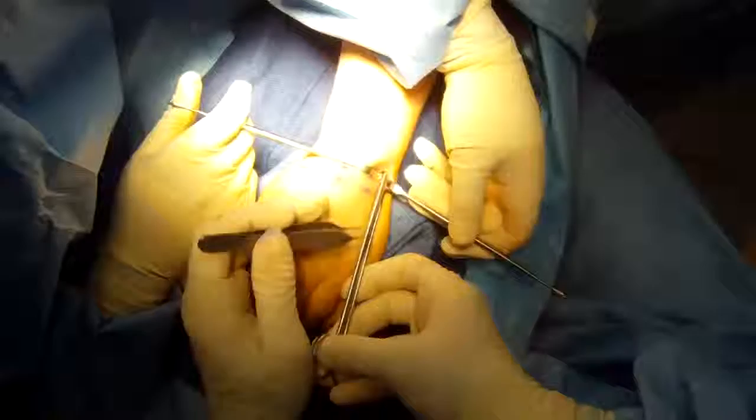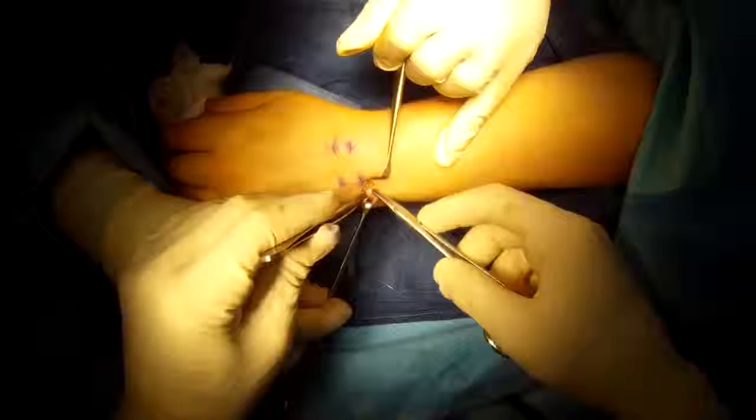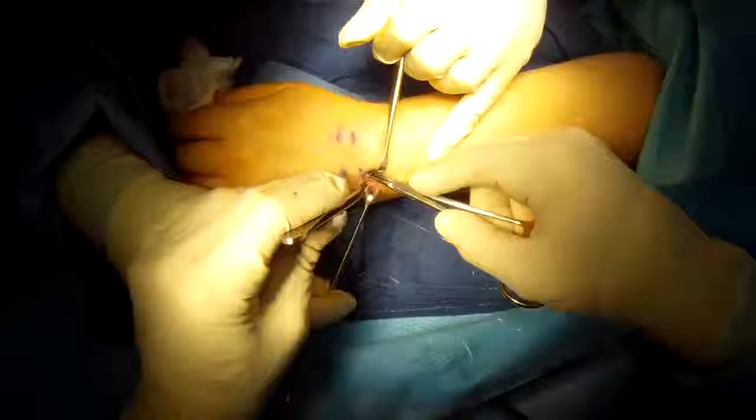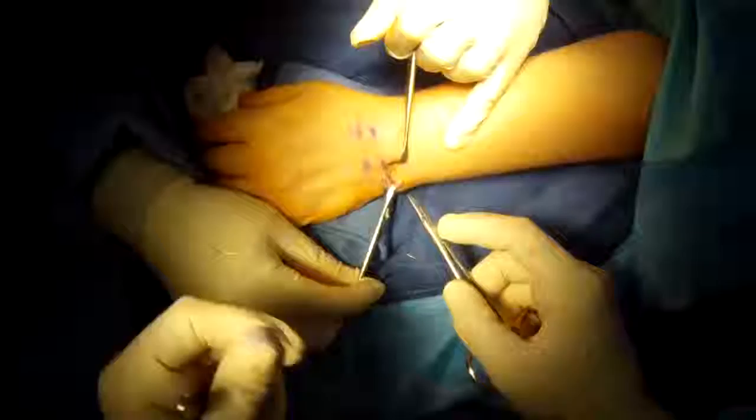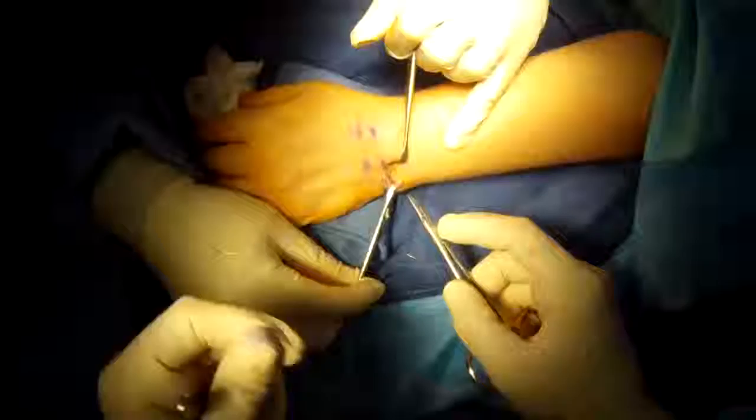I go into the forearm, release it, and I can see there's plenty of room there — I can get the scissor easily up the forearm. I just close one of the layers over it to restore the anatomy, leaving plenty of room for the tendon to move without being pinched. All done.